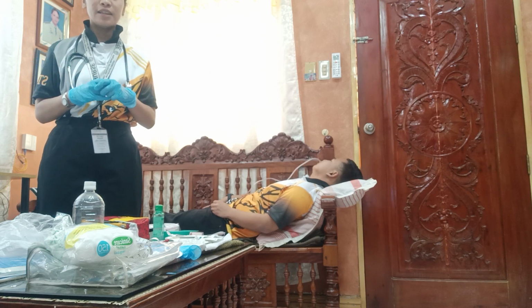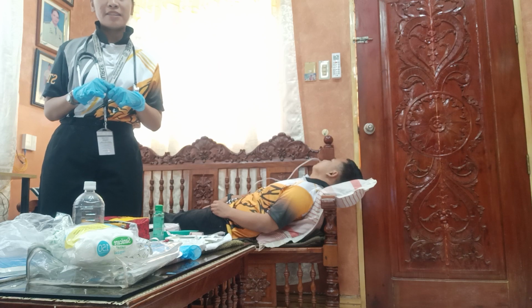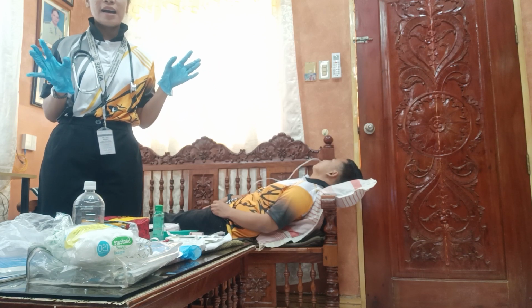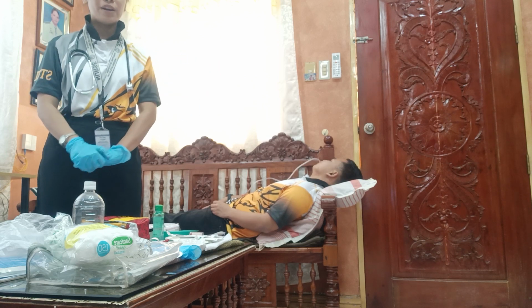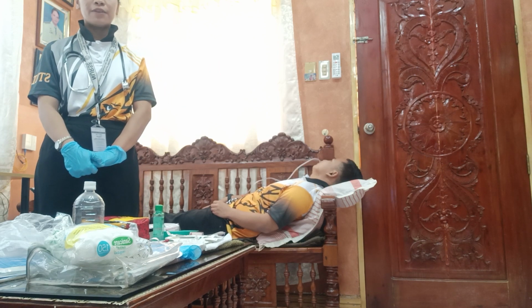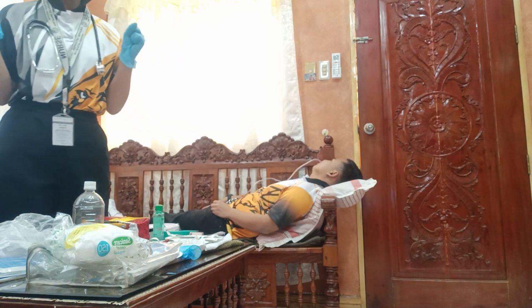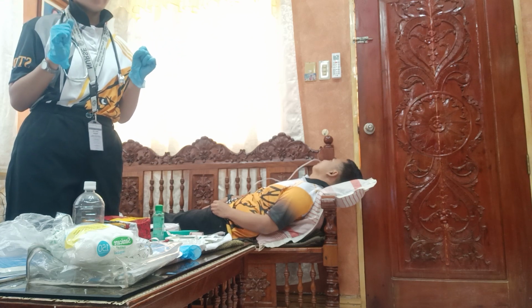Research demonstrates that the use of pH is predictive of the correct placement. The pH po of gastric contents is acidic, less than 5.5 if the patient is not taking an acid inhibiting agent. The range may be 4.0 to 6.0.